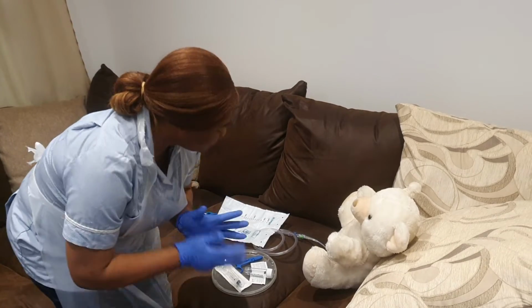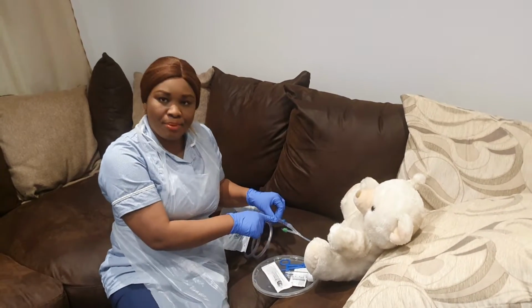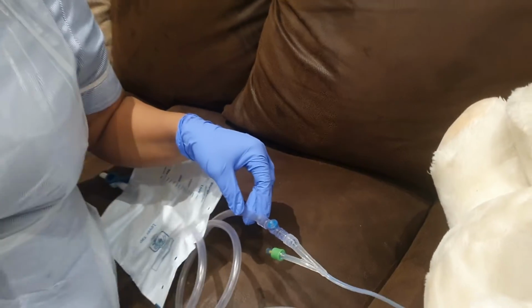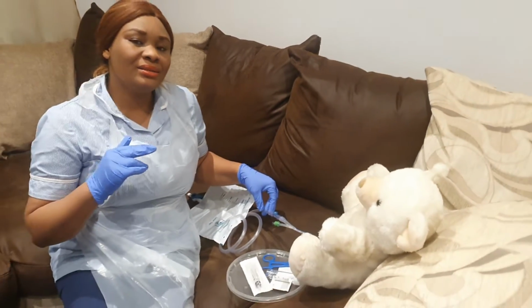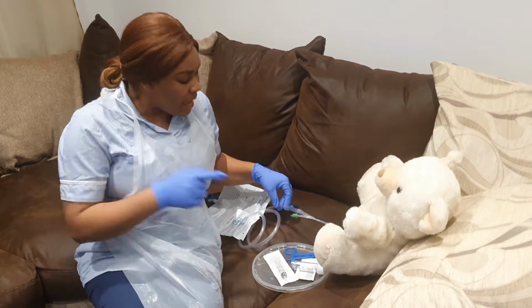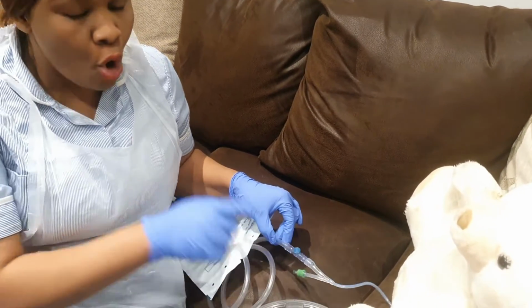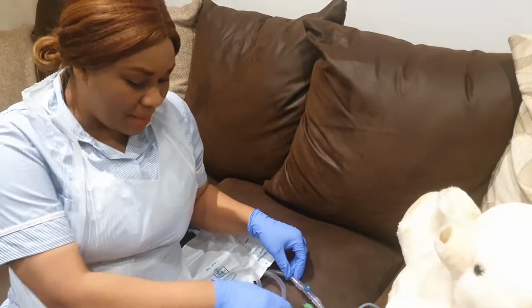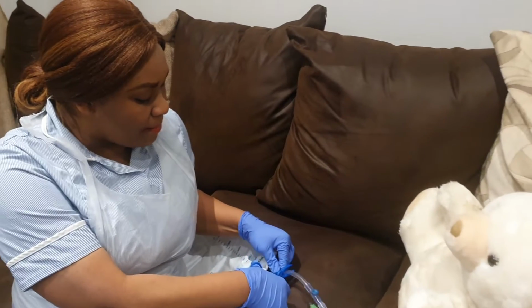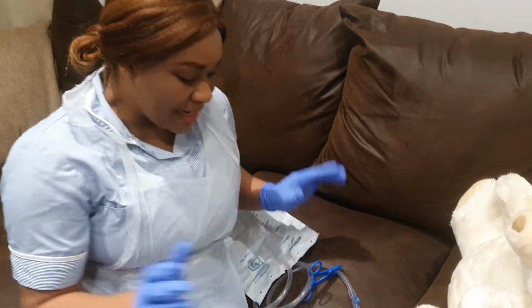Okay. Lovely. So guys, you are to clamp the catheter distal to the sampling pod. When I say distal to the sampling pod, I mean just after the sampling pod. There are two ways. Or you can clamp the catheter 2 to 3 centimeters away from the sampling pod. So it's actually your choice. So I'm just going to be clamping my catheter now. I'll clamp distal to the sampling pod. So I've clamped my catheter now.